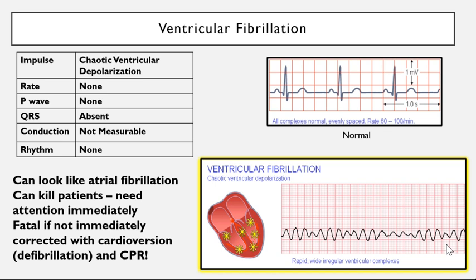So yeah, obviously you don't have any appreciable contraction of the heart. It's originating from the wrong spots. These are really, really bad problems. There's not even really an appreciable heart rate, because it's almost like a flat line. We don't have any appreciable contraction of the ventricles at all.